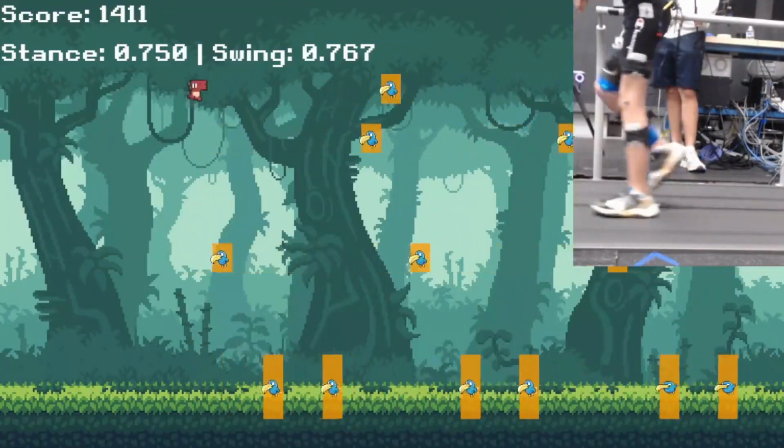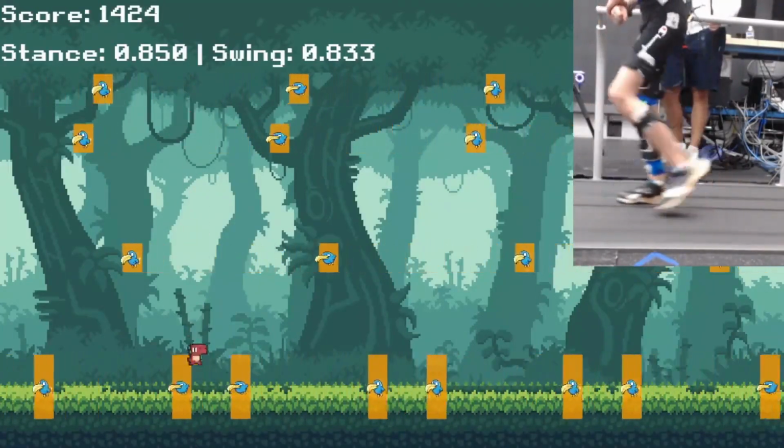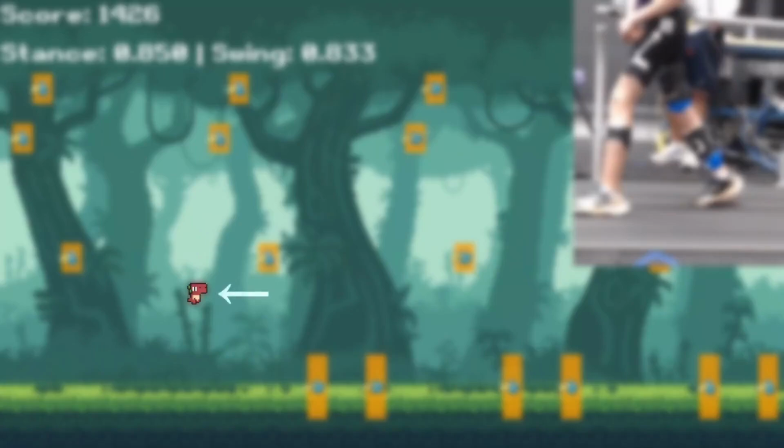The biofeedback game focused around instructing the user to perform a specific knee kinematic profile. The user-controlled avatar, the little red dinosaur, is controlled up and down by the knee flexion of the user, moving along the screen as they extend and flex their knee.